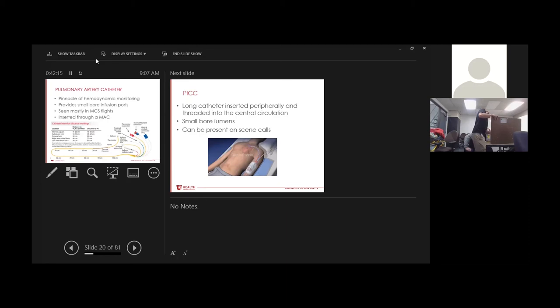Exactly. Okay. So following this back, this has a syringe that inflates the balloon. It's going to give us an idea of the left ventricle, and we're going to go into those numbers. So key things about this: this little syringe opens and closes. We want to leave it open, that way, if anyone left air in it, the lock is always open.